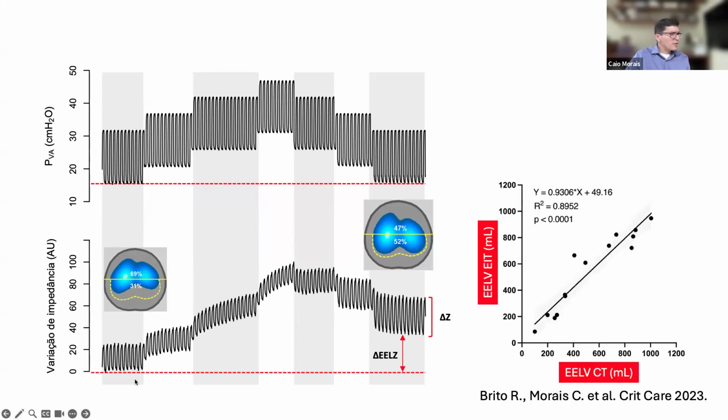And additionally, we can believe in the change in the end expiratory lung volume assessed by EIT. This is a recent paper we published showing that EIT and CT agree with this change in lung aeration. So this is an easy way to monitor the change in aeration at the bedside as well.